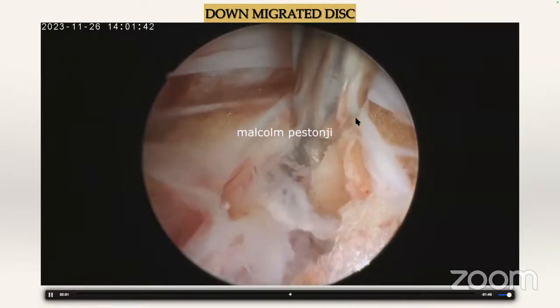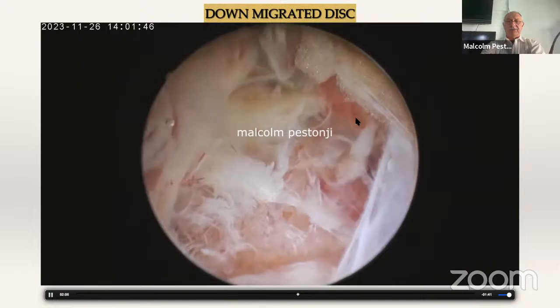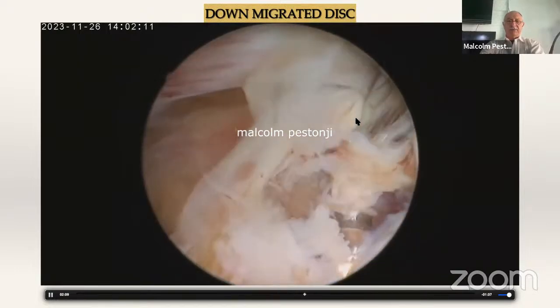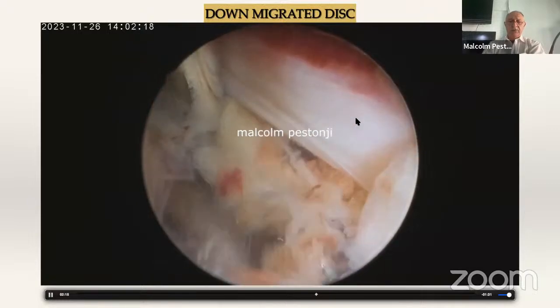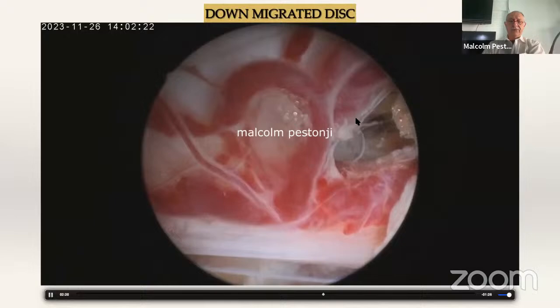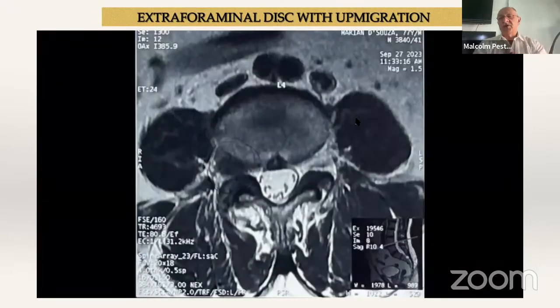Yes, we can. I'm going to go underneath it. I'm going to see on the vertebral surface. I'm going to make sure I have left nothing behind, and bang, one more small piece comes out. So, probing the subligamentous spaces is of great vital essence. Removing thick subligamentous tissue.